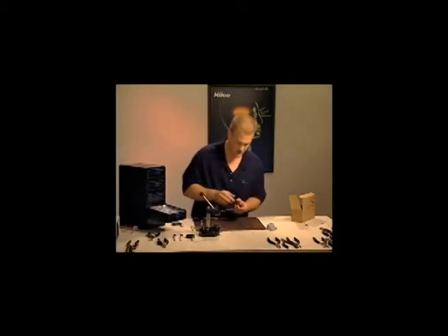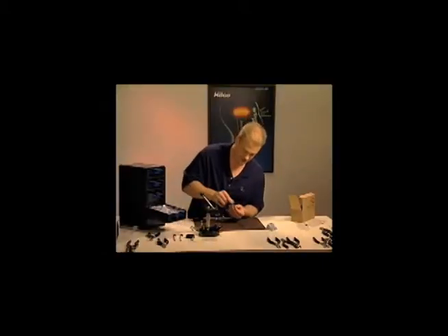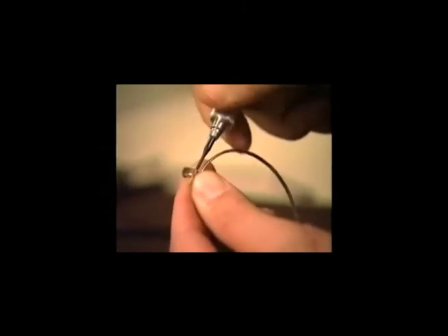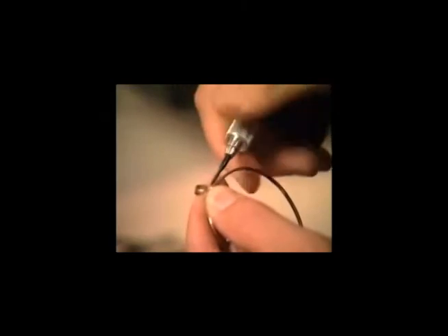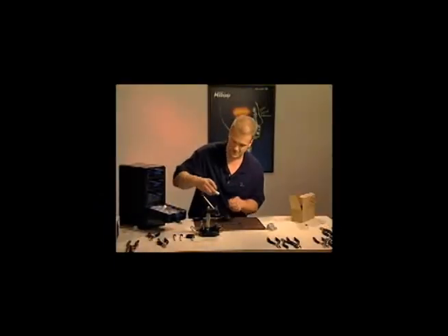Spill out a screw. And we'll put this one in the closing barrel. Pass it through the bottom. Get it started. Right now, I know that this is going to be just a little bit too small because the threads are passing through the closing barrel, but it's a good starting point. I'll thread that all the way down just to be assured, and it probably won't tighten up, which is okay. I can just back that out. And if you jumped right to a 1.5, it would just cut new threads anyway. I just want to come as close to that hole diameter as I possibly can. So I jump up to a 1.5.